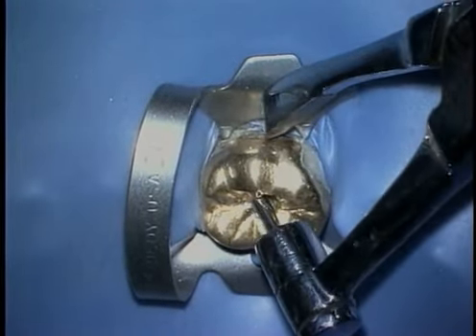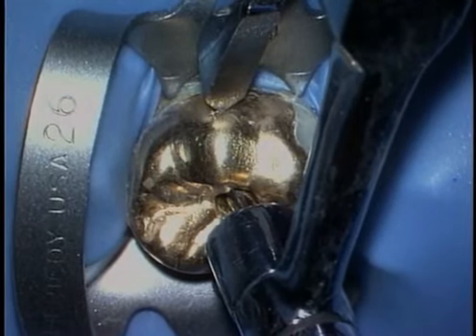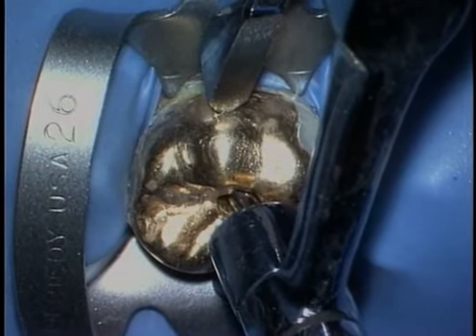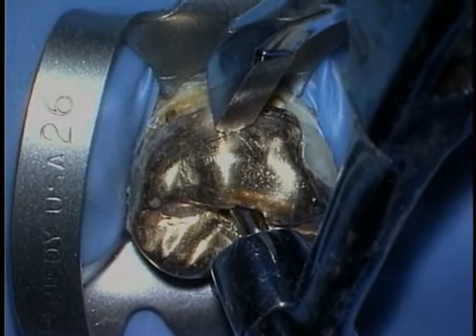To ensure a stable and strong grip, place the removal tip below the height of contour. Gently squeezing the handles of the Klein plier will generate sufficient opposing pressure and typically will lift the restoration off the tooth.